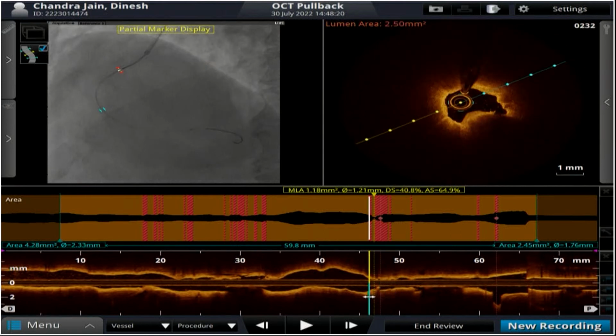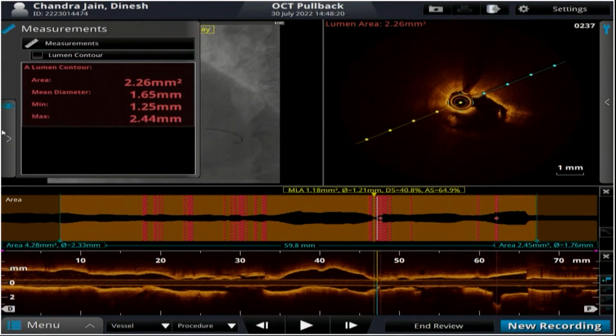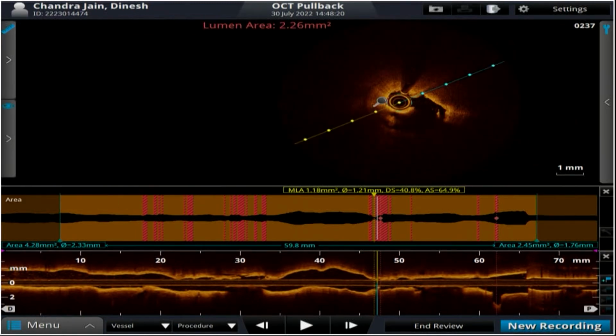It's still in the part where we intend to do a dissection. It's not outside the area we didn't intend to do a dissection. So let's take a 2.75, 38, Alpine.